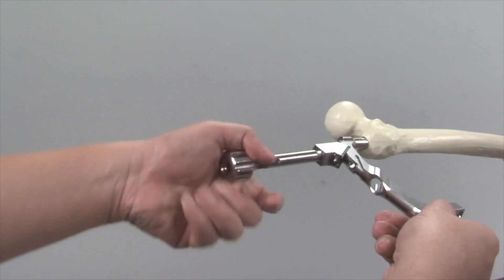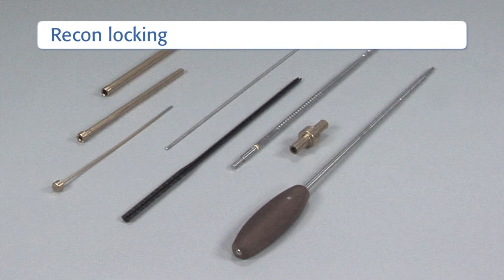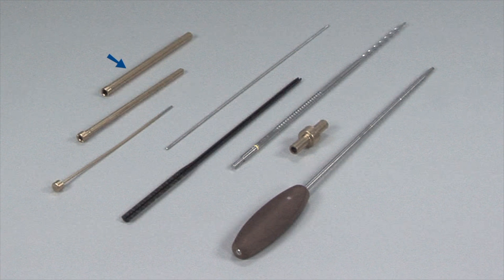The connector is now removed. To insert the recon locking screws, the following instruments are needed: the 11.5×8.5 protection sleeve, the 8.5×3.2 drill sleeve, the 3.2mm trocar, the 3.2mm guide wire, the direct measuring device, the 4.5×6.5mm reamer, the fixation sleeve, and the T25 star drive screwdriver.